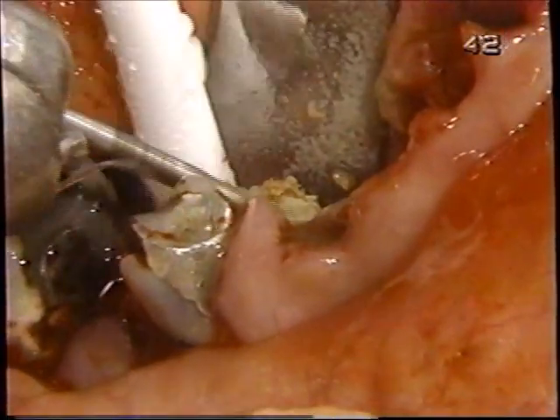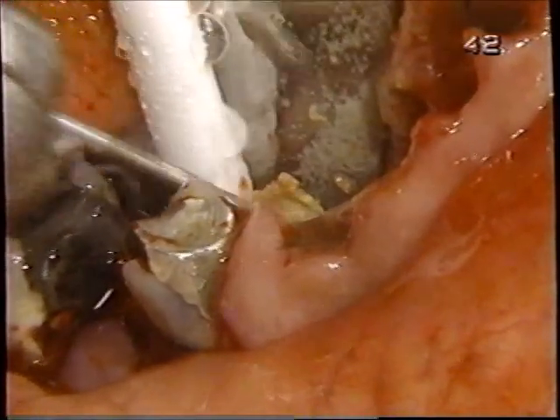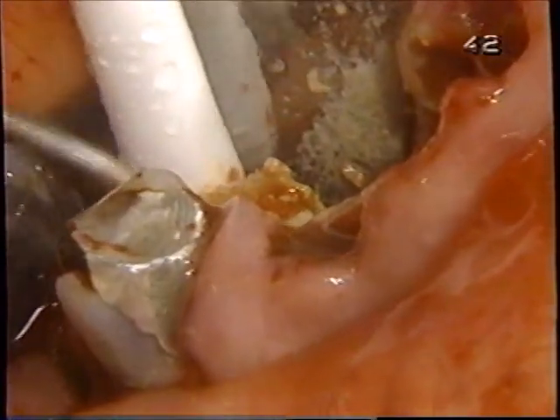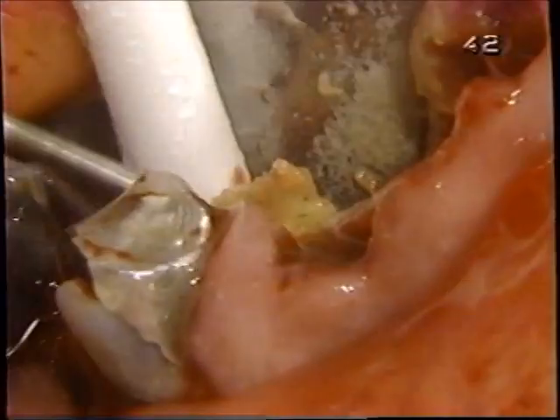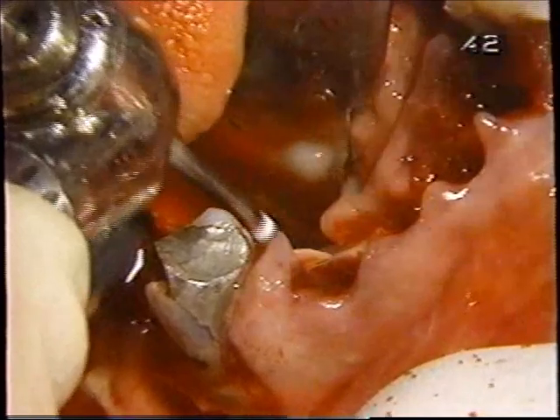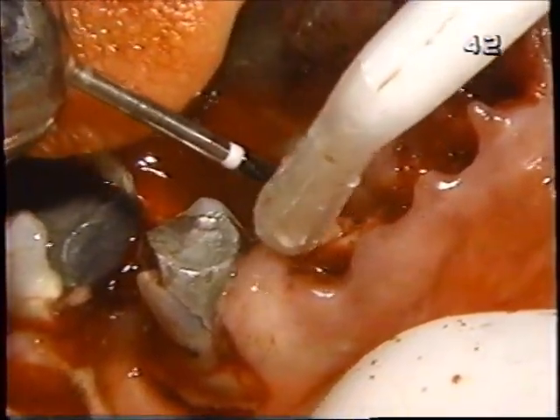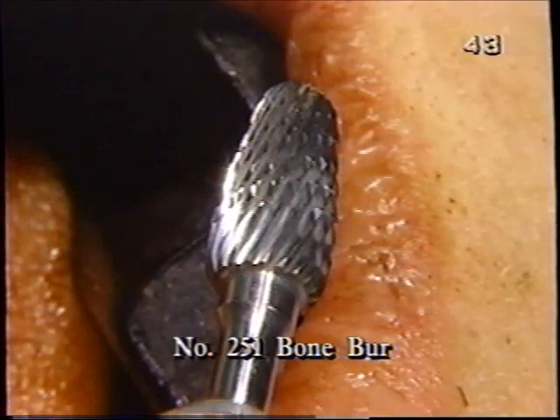So trying to maintain the overall bony contour of the ridge, so the continuity is maintained from incisor region to molar region. Okay, let's get it out. Take that piece of bone out. Okay, now let's just smooth it off. We're almost done.